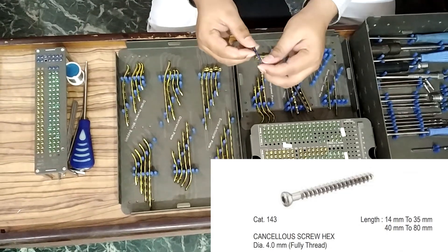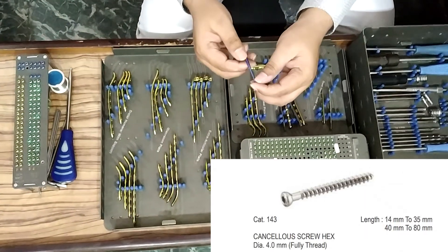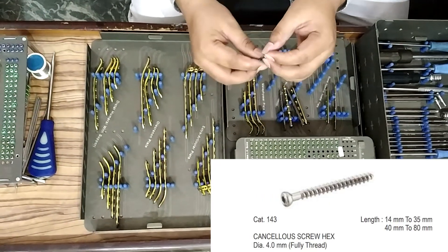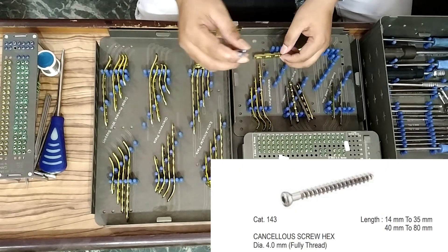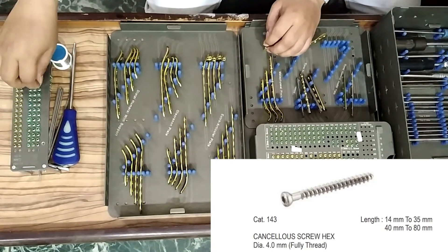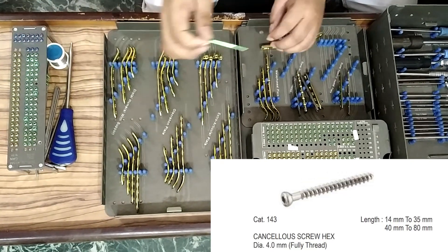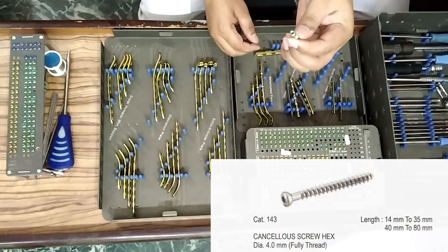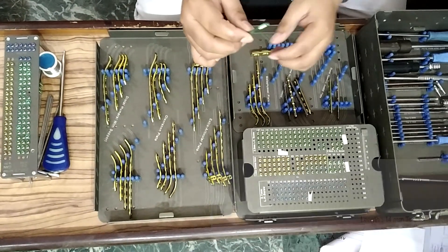Next, 4 mm full thread cancellous screw, 14 mm to 60 mm, two pieces each. From 14 mm to 30 mm the gap is 2 mm, but from 30 mm the gap becomes 5 mm.